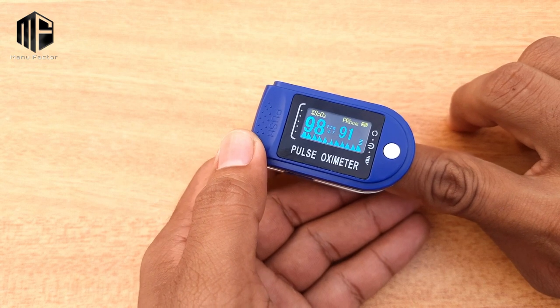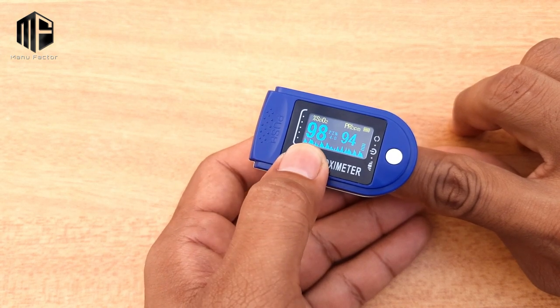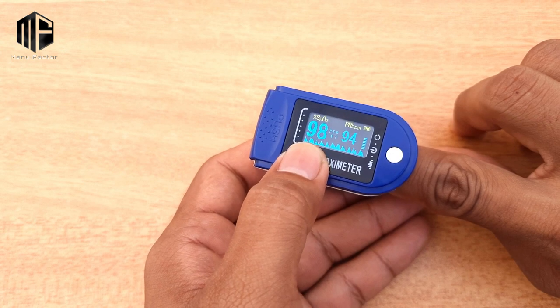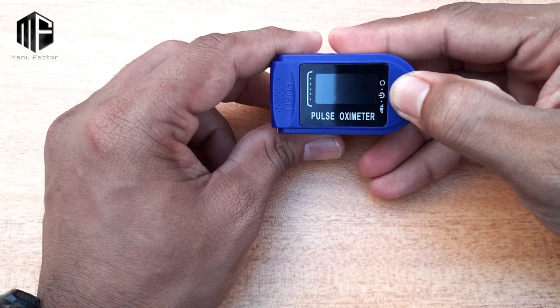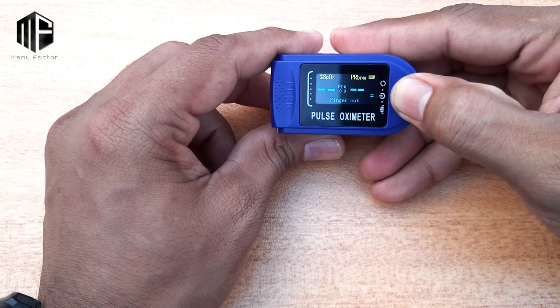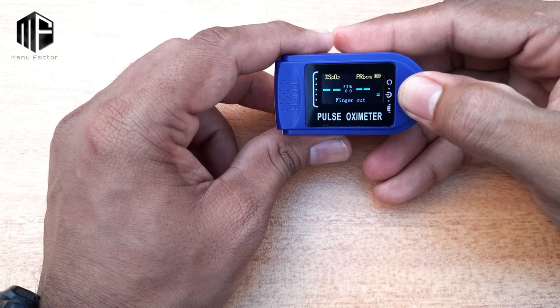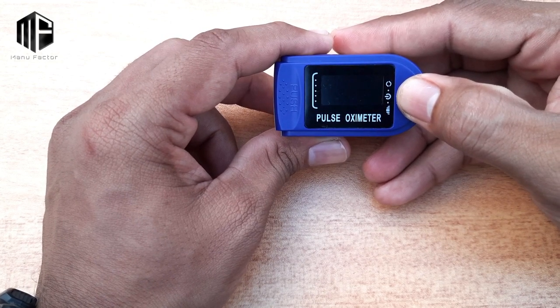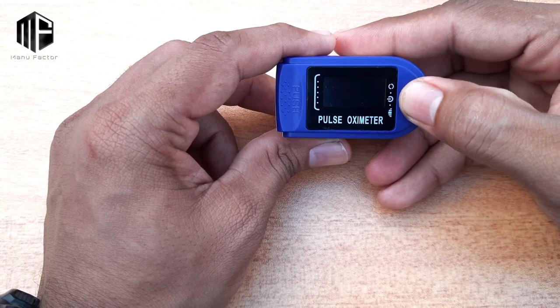SpO2 is the oxygen level or oxygen concentration. The normal average value is 95 to 100. I have a medical background. When we press the power button, the normal healthy SpO2 range is 95 to 100. If it is 94 or below, it is very low — that means oxygen level is critically low.